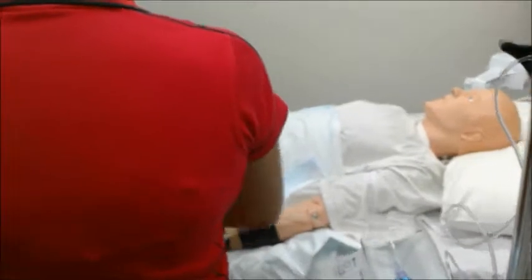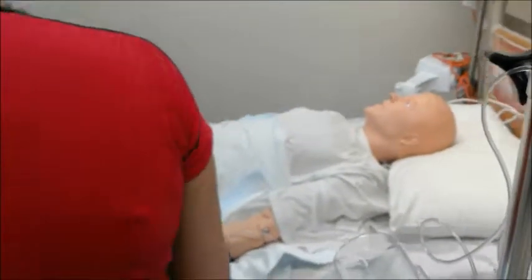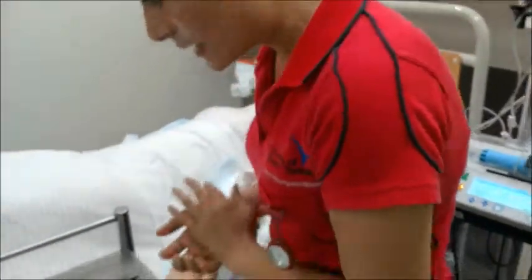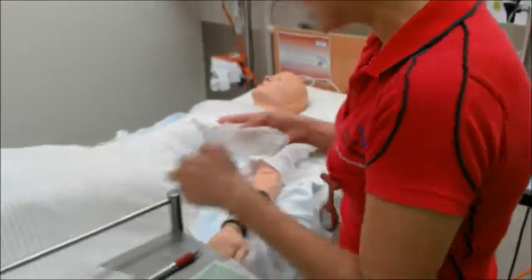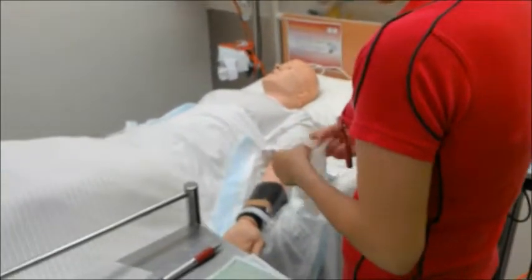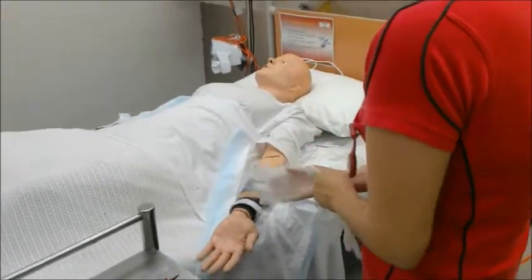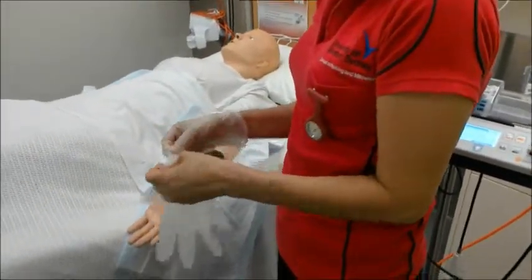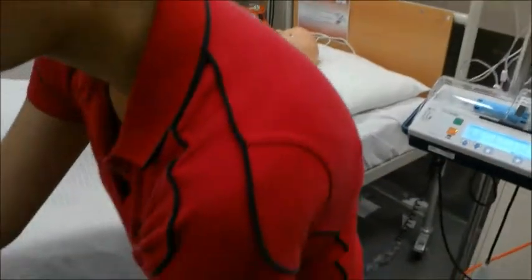Okay, Mrs. Adib, I have already checked your cannula site. Now I'm just going to clean it before I connect this line to you. Could I have this swab, please?